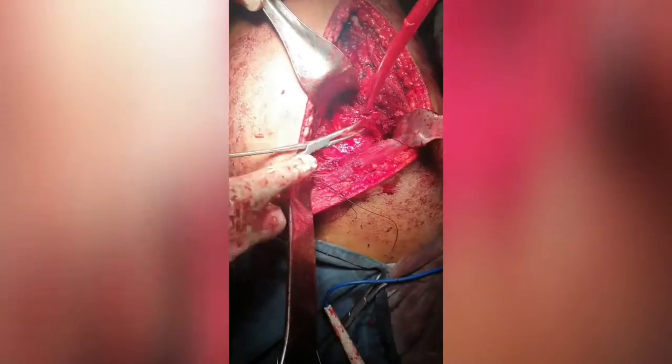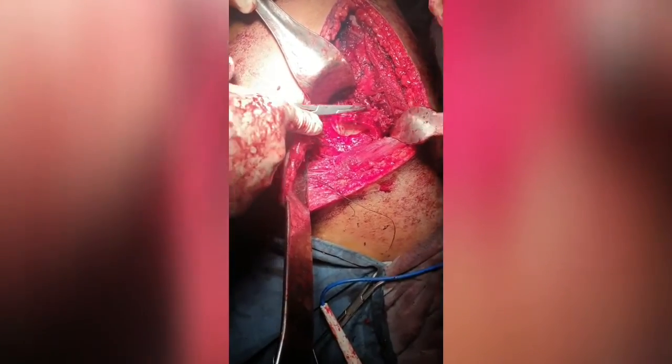So this is the exposure. This is the head. This is the fractured acetabulum. There is a large fragment in the acetabulum. You can see there is a large fragment in the acetabulum. This is the posterior wall of the acetabulum.